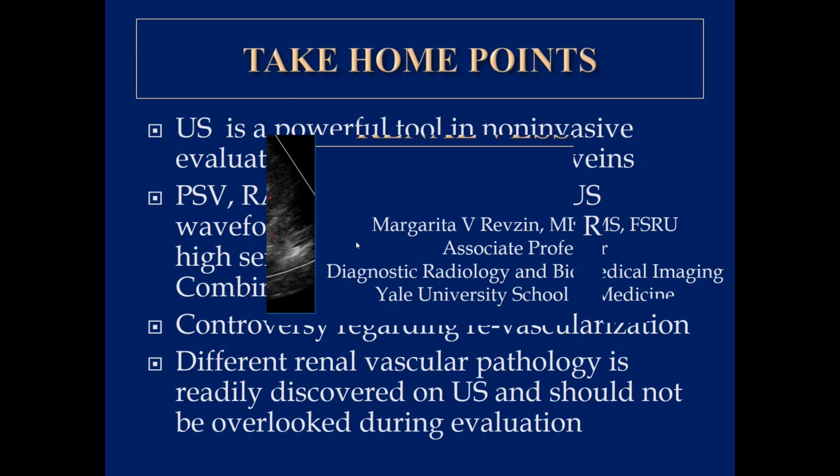So what I teach our sonographers is to just use your patient's weight, and not just to perform the procedure, but apply a lot of weight with your transducer on the abdomen, and gradually push into the belly. And it's important not to push very quickly into the belly, but a very gradual application of your weight, so that will really remove the bowel loops from the course of your transducer and will really open up all the vessels much better.